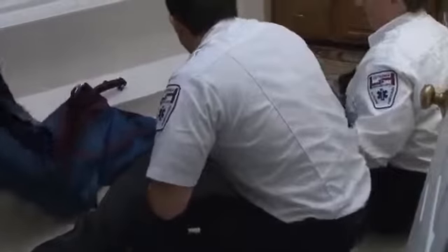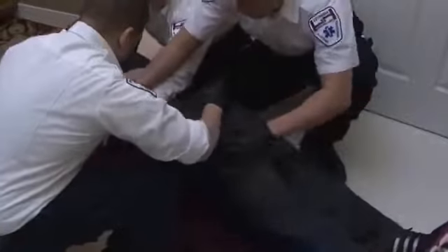If the patient is on the floor and needs to be lifted in a supine position, log roll the patient onto the Evacuation HoverJack 2 or onto the HoverMatt air transfer mattress if available. In this case, the patient has fallen in the bathroom and the crew will use the HoverMatt to extract the patient from the space and move him onto the deflated Evacuation HoverJack 2. Secure as much of the HoverMatt under your patient as possible using a log rolling technique. Inflate the HoverMatt and move the patient from the fall site onto the deflated Evacuation HoverJack 2.